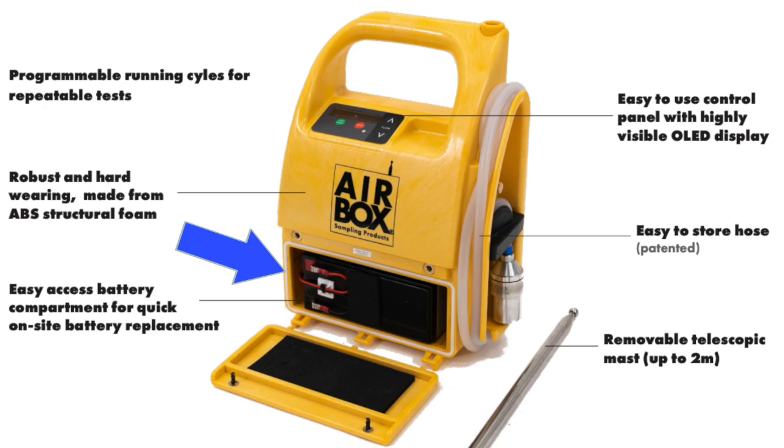This is run off a sealed lead acid battery. So again, there's such a wide array of batteries available out there, and we wanted a battery that has the run times that you need but is also widely accessible. Sealed lead acid batteries are very common in industrial use, in maritime and security products.